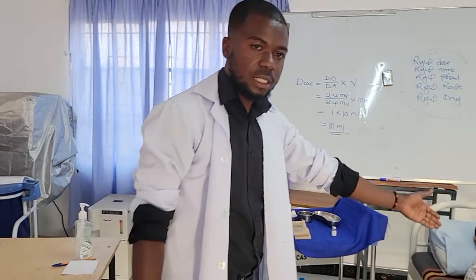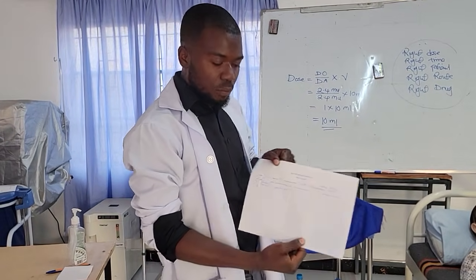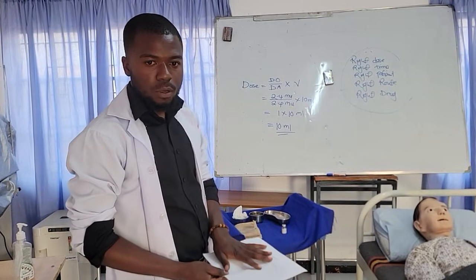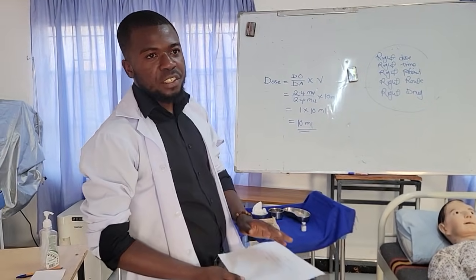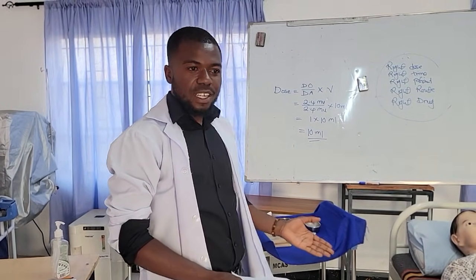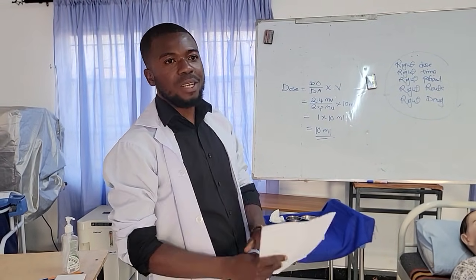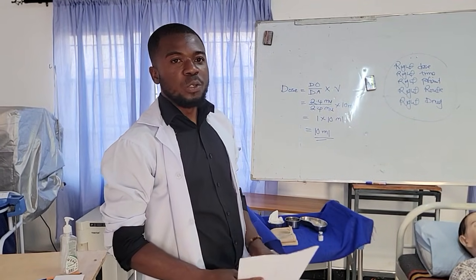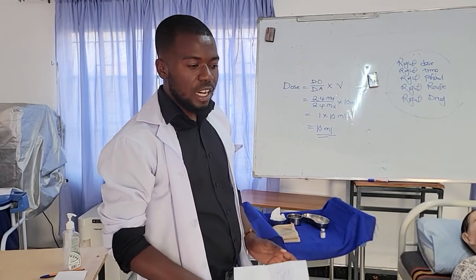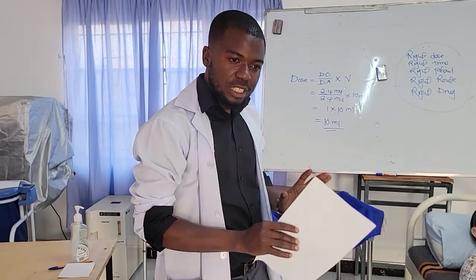We also have the patient this side. With me is a drug chart with all the details of the patient and the drug itself. Injection giving is a semi-sterile procedure, so you still need to maintain sterility. You use what is known as aseptic non-touch technique. You don't have to contaminate, and for this procedure, you don't need to don gloves.